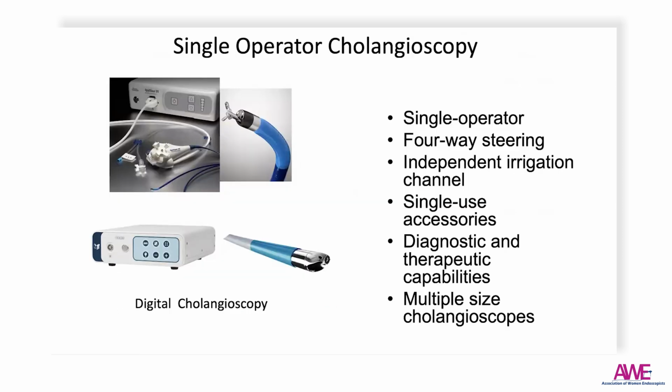So let's go into a little bit about cholangioscopy. This has now been well established as a modality. It's a catheter-based visualization system that fits through the ERCP scope. Traditionally, we had one system available to us. Now we have multiple manufacturers creating similar products. They range now in size to help deal with different size or caliber ducts, which can sometimes be an issue when dealing with indeterminate strictures, that there's sort of a normal or a thin distal duct.